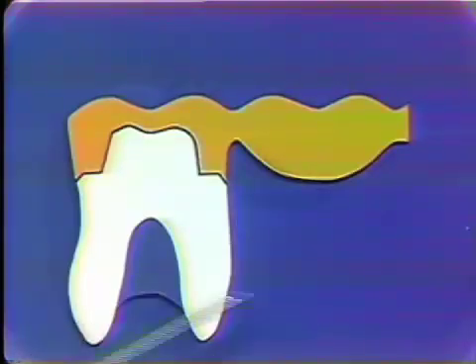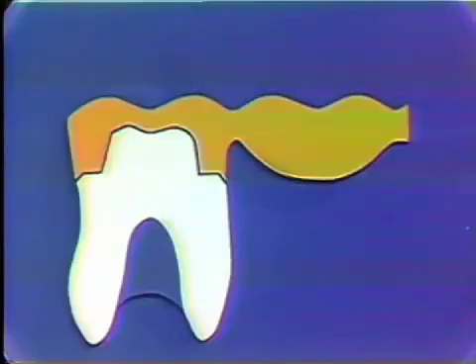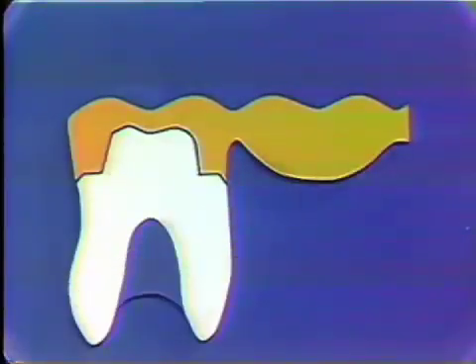Now that these two teeth are linked together by the bridge, the whole thing has to accept stress and respond to it as a unit. And any weak link within this structure is liable to fracture and to dislodge the bridge. Let's see what happens when the anterior component of force operates on this particular bridge.